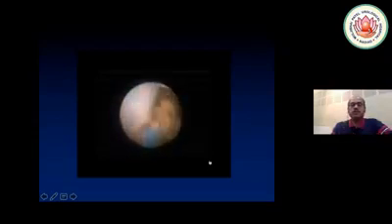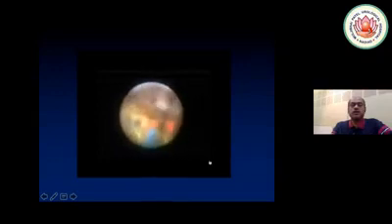The stone is broken completely with the laser. Nowadays, we have so many high power lasers, the thulium laser and Moses, and so many advancements in laser technology. You can powder the stone or dust the stone completely by whatever settings you are putting. With microperk, the disadvantage is that stone fragments cannot be retrieved. But here, the important thing is that the whole stone was dusted out.